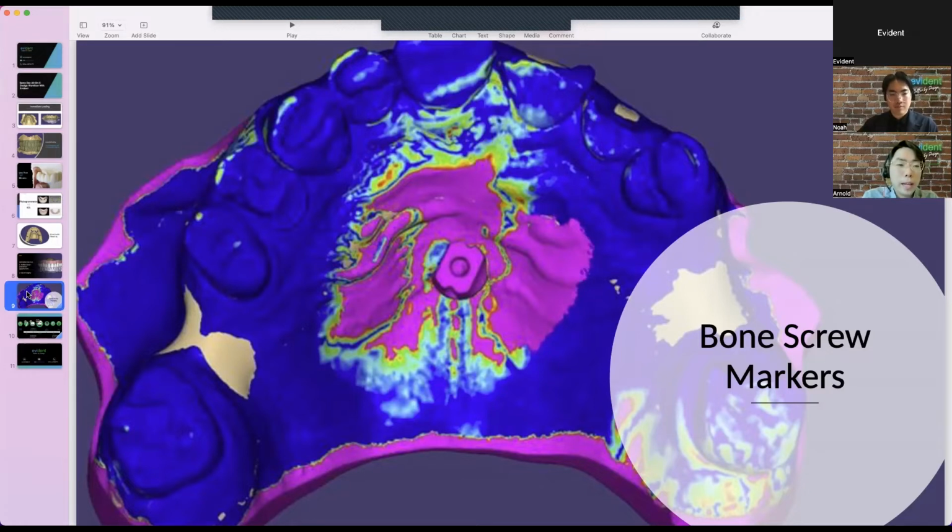So the next stage is take a pre-op scan that includes getting all the bone screws in the scan. Then you can send this data to designers so they can get a good idea of what the restoration is going to look like and maybe even make a pre-op restoration, right? And then extract the teeth and place implants and put the MUAs in. This is where we could debate a little depending on what types of technology you have. So I'm giving you this workflow under the assumption that you don't have the photogrammetry such as iCam4D or PIC imaging system, right?